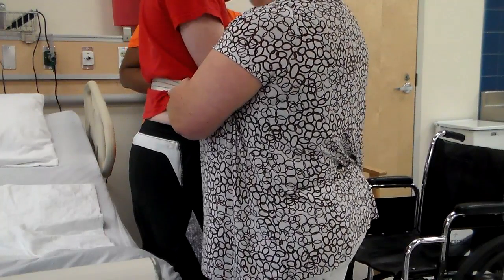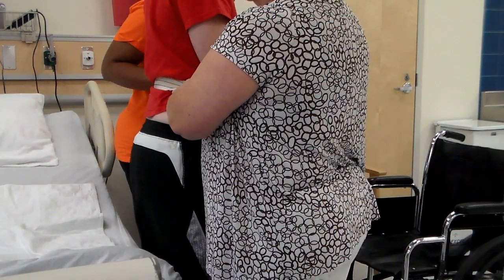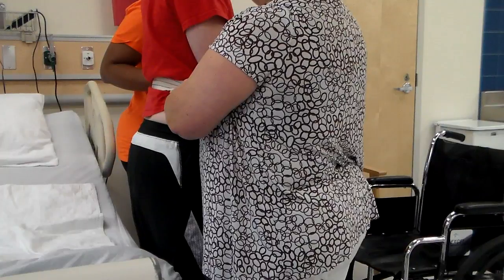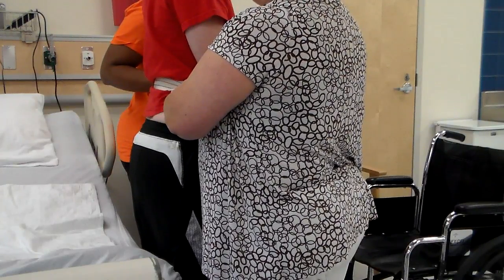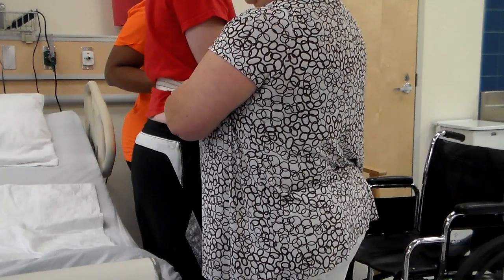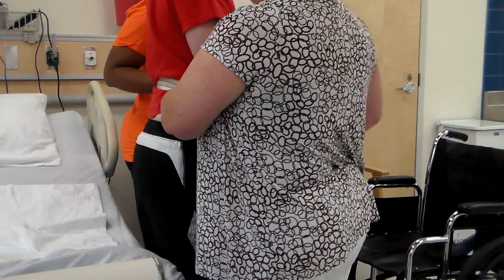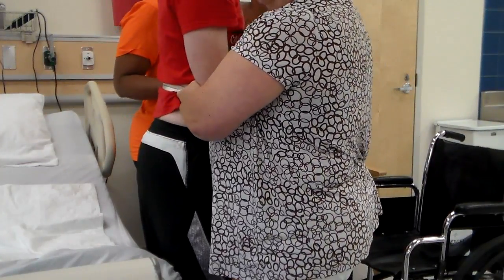Do you feel okay? Good. Yeah. Good, good. So now what we're going to do is we're going to pivot. We're going to turn and pivot as one team, okay? So you're going to establish that before you even start moving. And you're going to use the patient's right and left, okay? So this would be his right, yes? And this would be his left over there.